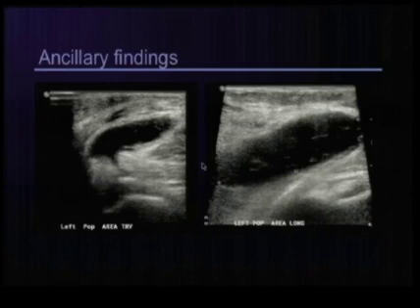And there is a jerk reaction when people see a cyst in the popliteal fossa. They tend to call these Baker cysts automatically. But the one caveat is that in a small proportion of these patients, synovial sarcomas may present with the same appearance as a Baker cyst. So we prefer to image what we think are Baker cysts with the three landmarks present. Now, a Baker cyst is nothing but distension of the gastrocnemius semimembranosus bursa.